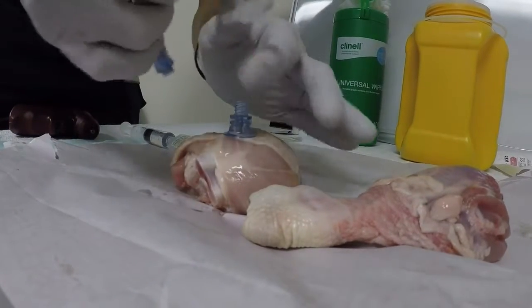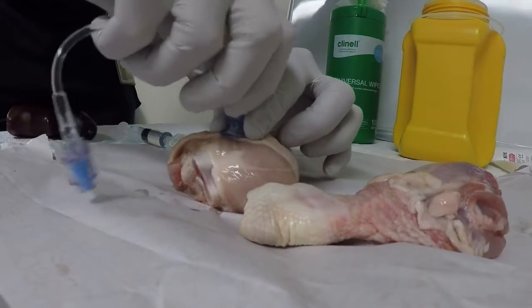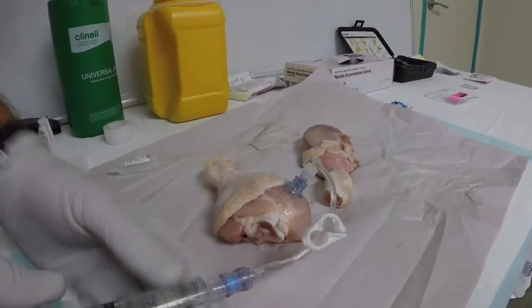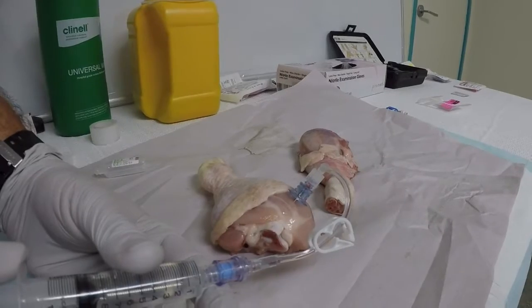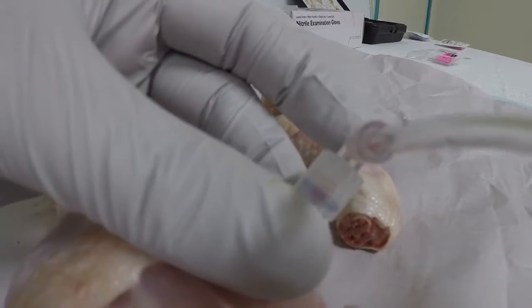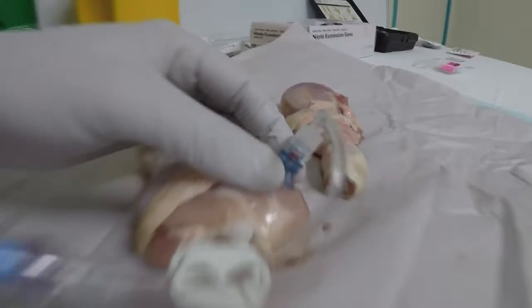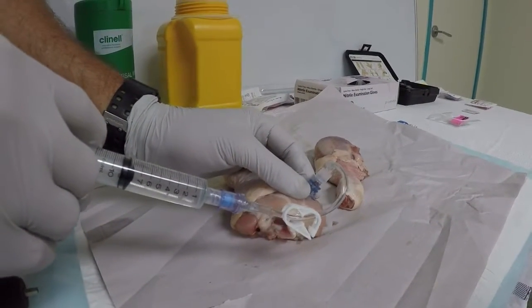Going to add our extension line. Once we've added the extension line, we aspirate backwards with gentle traction, looking for the presence of blood or bone marrow, which you can see we've got in the line, confirming that we're into the medullary cavity. We then, if it's an unconscious patient, flush fluid into the medullary cavity to ensure we've got patency.